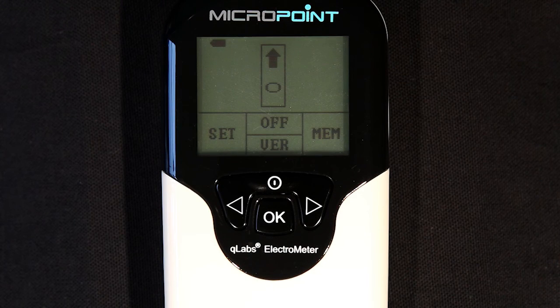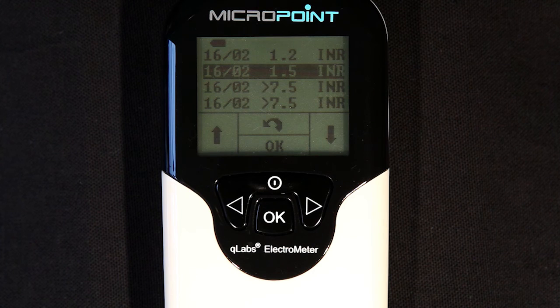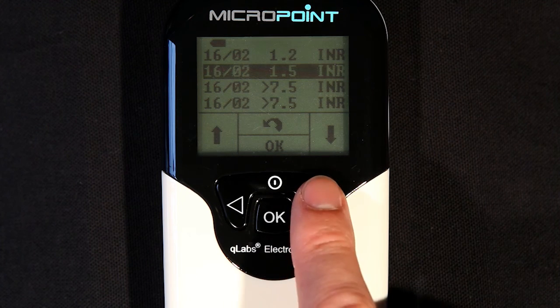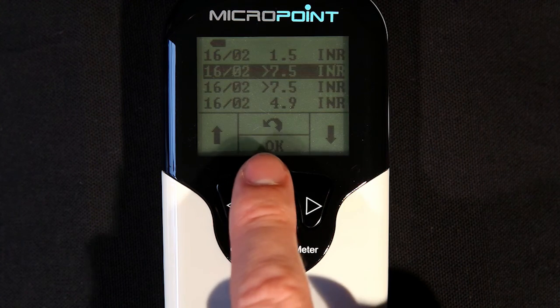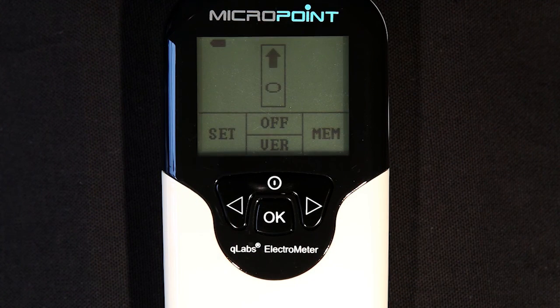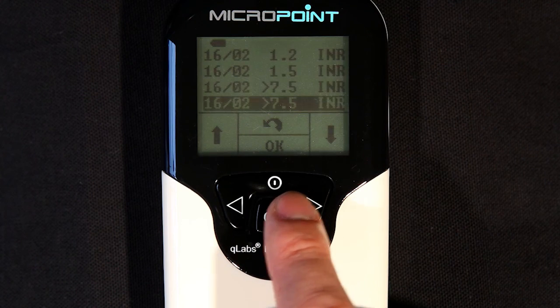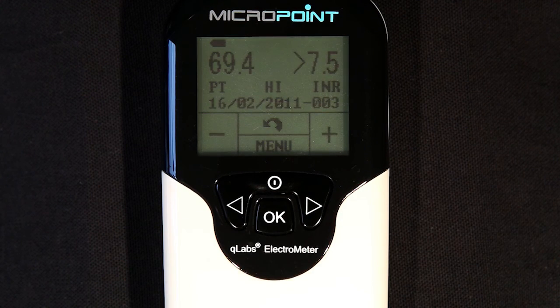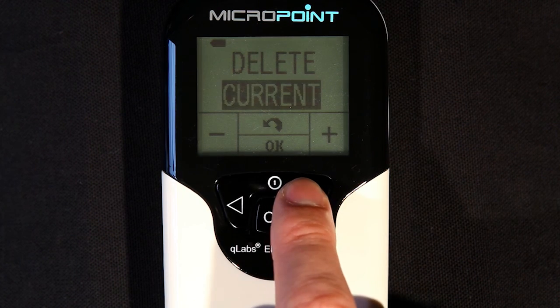To review results previously tested on the Q-Labs Electrometer, press the right button to enter the memo mode. The plus button will scroll through the page of results. To return to the test mode, press the return button. Or, to view the detailed information of a test, highlight the desired test and press the OK button. Press the menu button to delete the result currently being viewed or all the stored data.